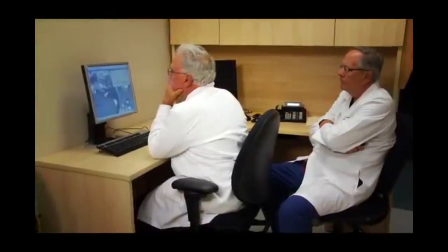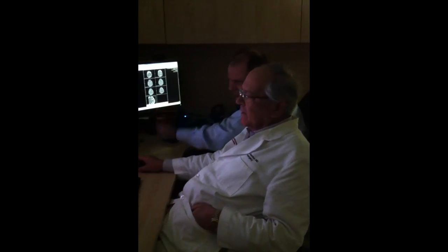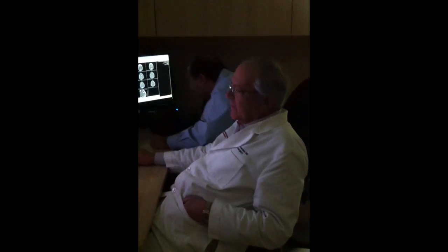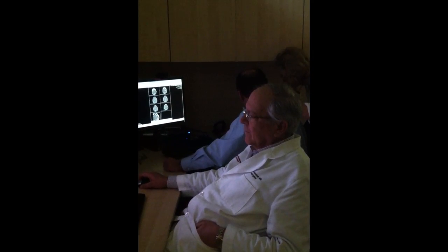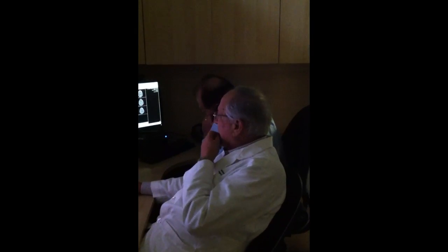Once the images have been taken, you can rest while the doctors and a radiation physicist develop your treatment plan. They're going from the top of the head down to the bottom, looking at the brain and trying to find out which part to focus the gamma rays on to perform the surgery.